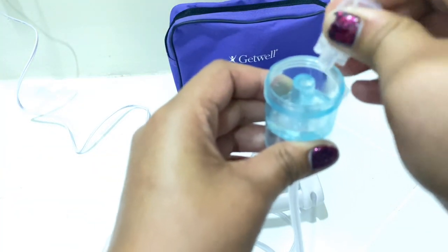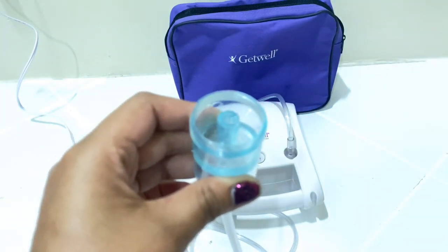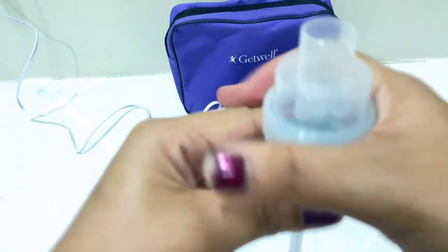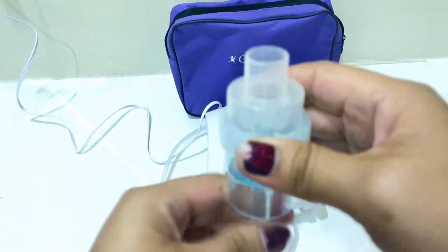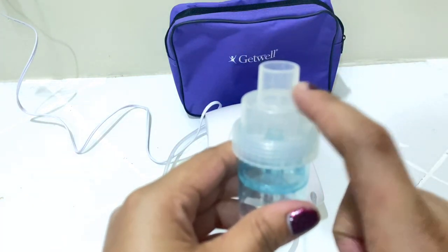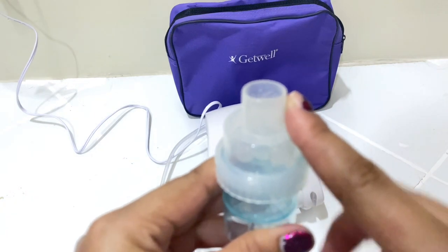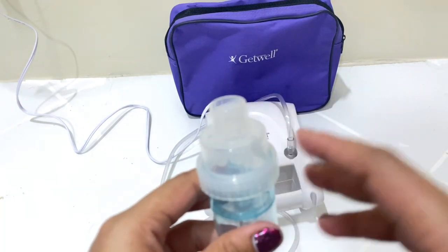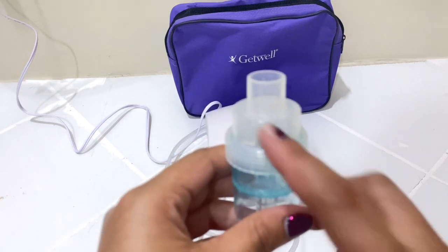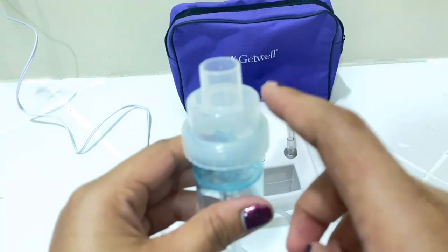You just have to put it really slowly. And then, cover the cup really tight. Ganyan. Pagkatapos natin ilagay ang medicine sa medicine bottle, this is the part where you connect your face mask or your mouthpiece. I don't have a mouthpiece or face mask with me, but dito siya sa upper part ng bottle, i-coconnect.